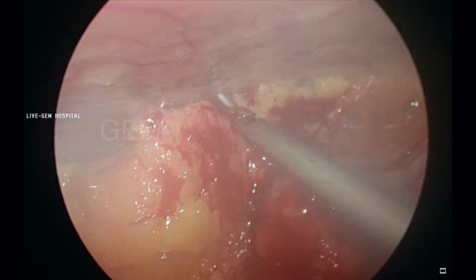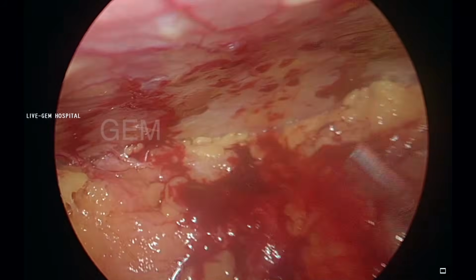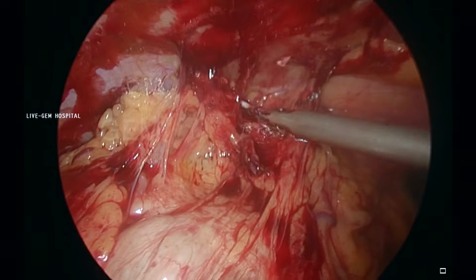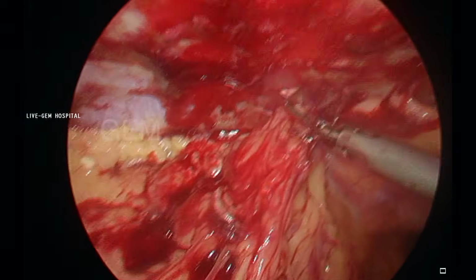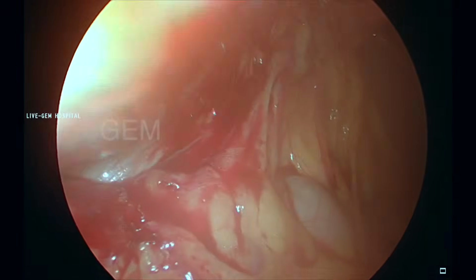The patient was treated somewhere and then came late. You can see this camera is not 4K, it's HD. It's from long back. It was done in 2019, almost 6 years before this surgery was done, and there are dense omental adhesions. When I go close to the gallbladder area, it was so dense.